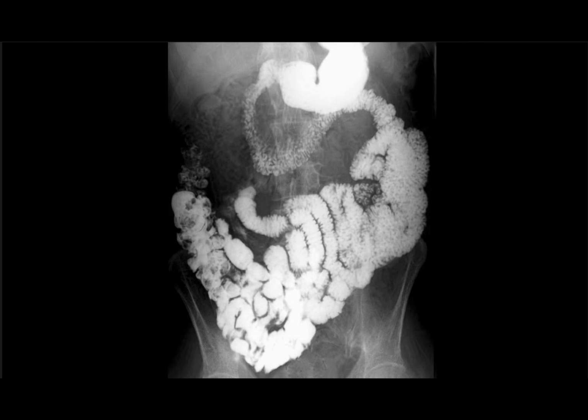Now look at this radiograph. This is the stomach. This is the duodenum. The first part, the second part, the third part, and then the fourth part of the duodenum. This is the jejunum. And then this is the ileum.